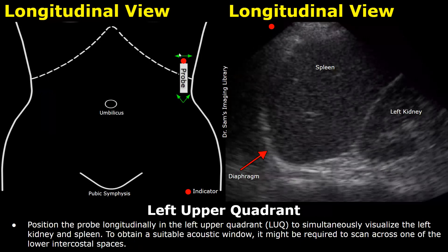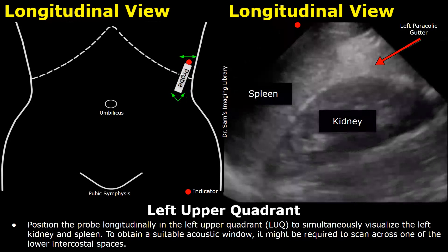Next, position the probe longitudinally in the left upper quadrant to view the left kidney and spleen, as well as the left hemidiaphragm and pleural space. You can scan across one of the lower intercostal spaces, or place the probe within the lower intercostal spaces for a better view and to remove rib shadows. You can place the probe in a one o'clock position. Fluid may be found between the spleen and the left kidney, and another important location is the left paracolic gutter, where fluid may also accumulate.